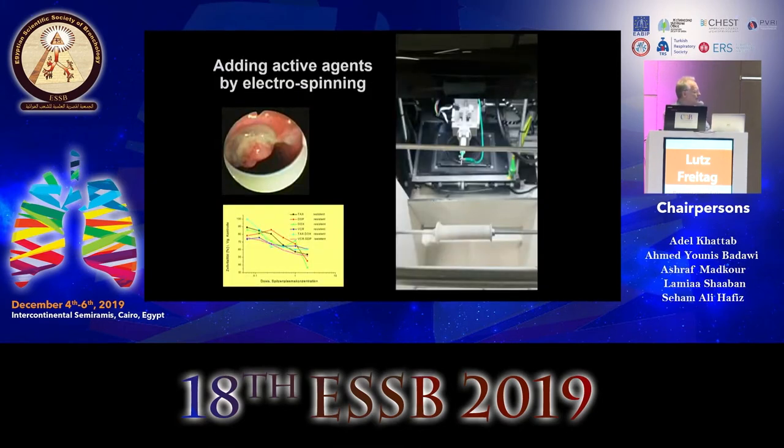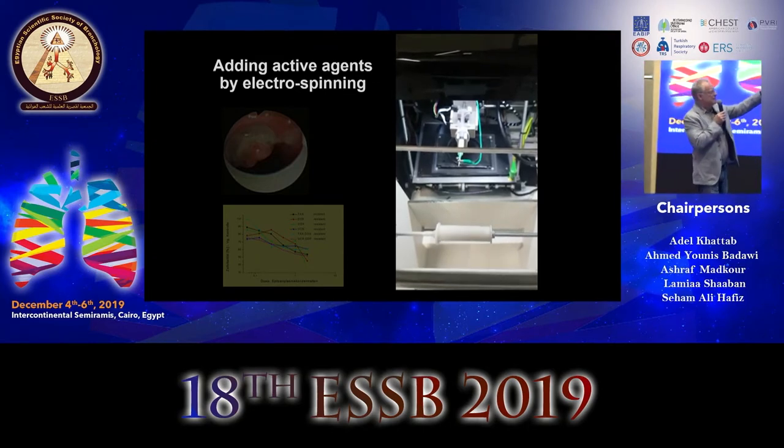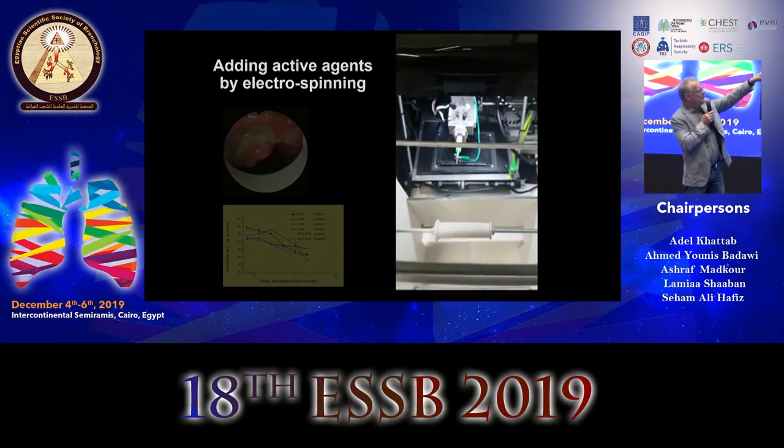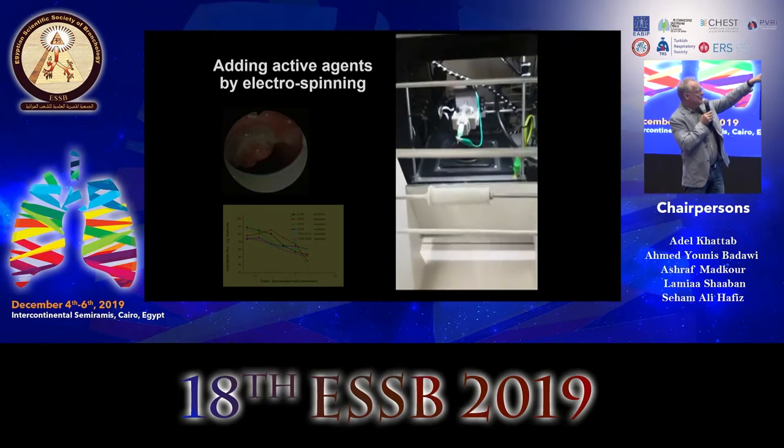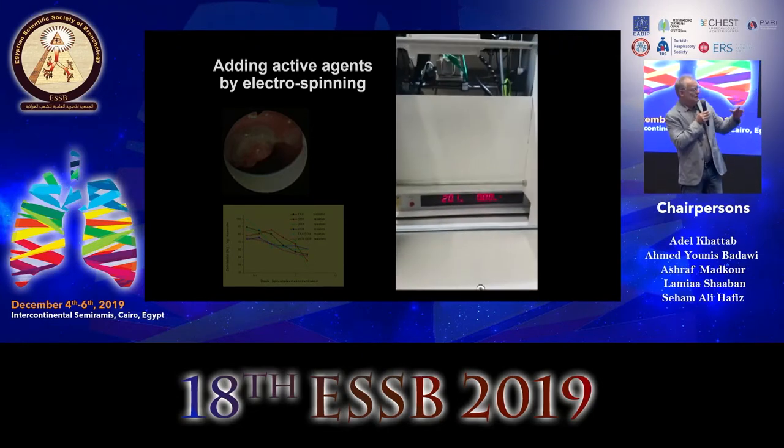Let me show what we can do. We tested the response of granulation tissue to some drugs, and then I bring these drugs onto the surface of the printed stent. So you see the printed stent here, it's spinning, and in the syringe is a cytotoxic drug, and the whole thing takes place under 20,000 volts.